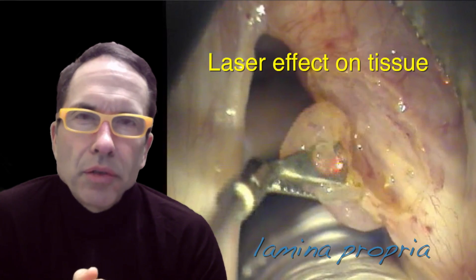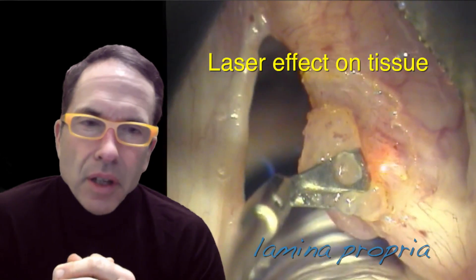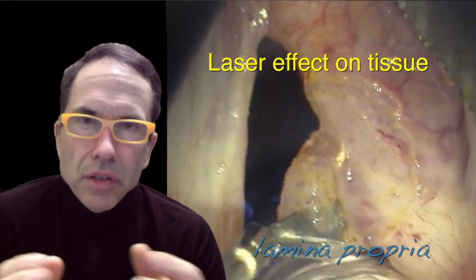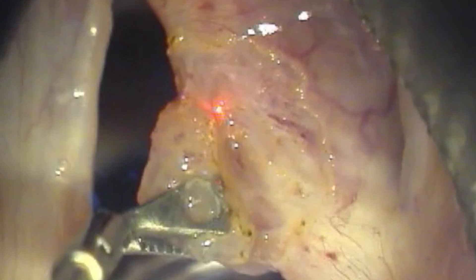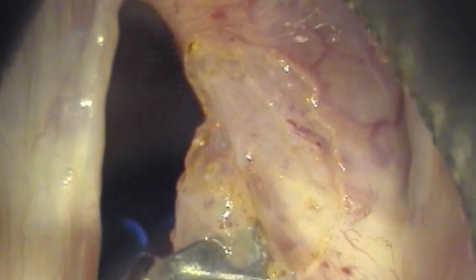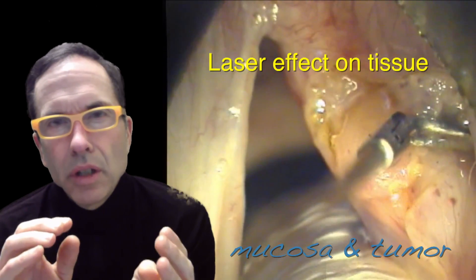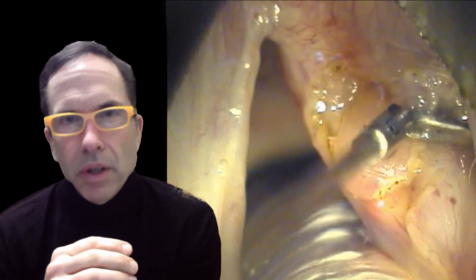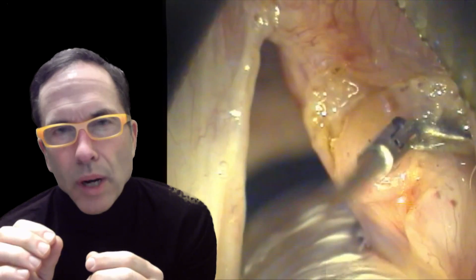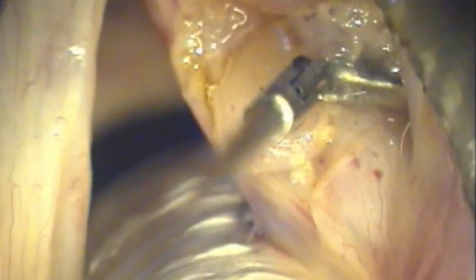Let's compare the laser effect on two different types of tissue. Starting with the lamina propria — the layer between the tumor and the muscle — when I fire the laser here, the tissue, which has been infiltrated by the saline and adrenaline, literally just vaporizes and disappears. These are the little microfibers in this area. Now let's compare this to the effect on the mucosa, specifically the interface between tumor and normal mucosa. Here when I fire the laser and aim on mucosa, one edge of the laser touches the tumor, and we can see coagulation and char — because the tumor absorbs more heat than the mucosa does.